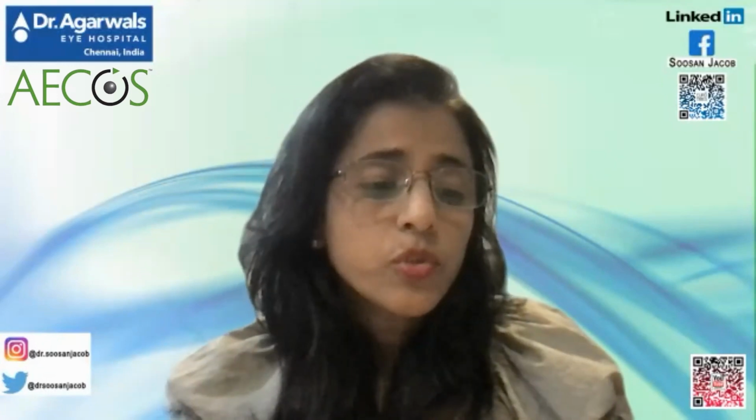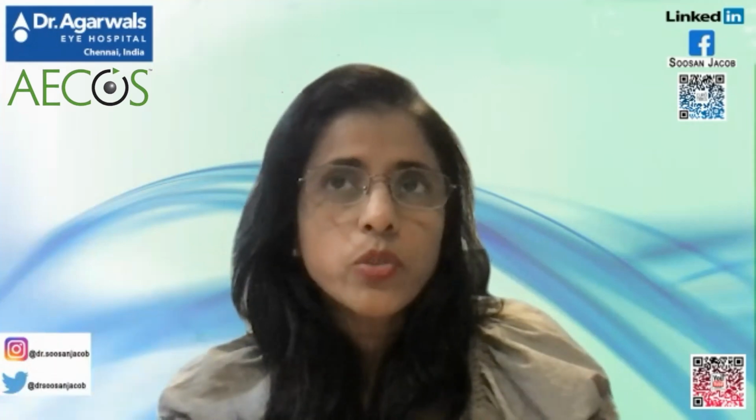Okay, but to understand you well, you think dehydration is the best tool to make it easier to insert these rings, correct? Yeah, Pavel, dehydration is a great technique, as you saw, but I don't think you really need to do it for every case. It's not a must. It's really a simple procedure. If you have the right instruments, like a curved Y, then you can easily push it in and get it into position. But if you want it to become even easier, you can do this.